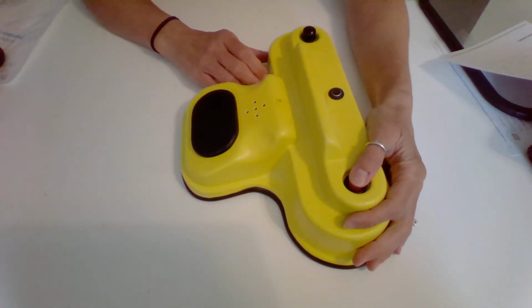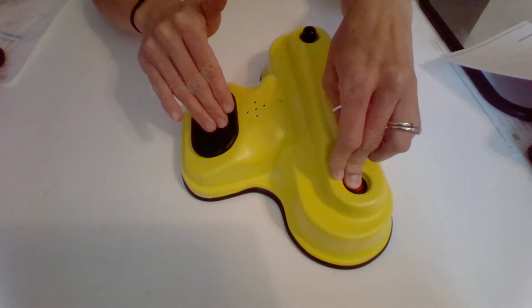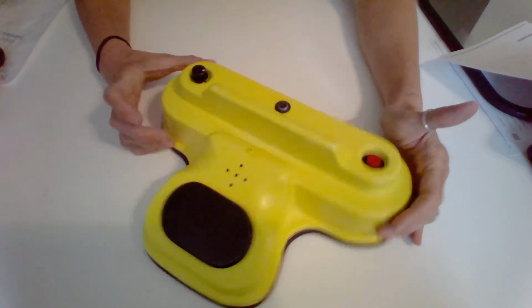Again, hold the red button down, hold it down the entire time. Keep pressing, pressing, pressing. Say whatever you want to say. When you're done recording, let go. Hands off, and then you will just hit this one time, this black button, and it will play what you have said.